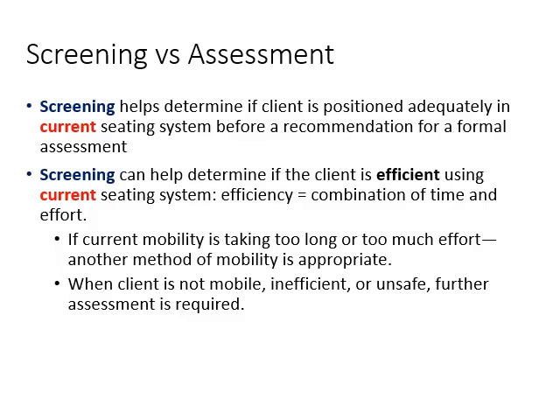What do we actually mean by a screen versus an assessment? So a screening helps to determine if the client is currently positioned adequately in their seating system, in their chair and their seat, to see whether they need a formal assessment. The screening helps to determine if the client is efficient using their current wheelchair.